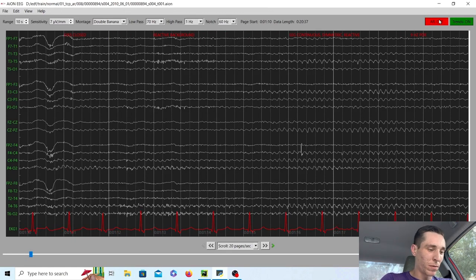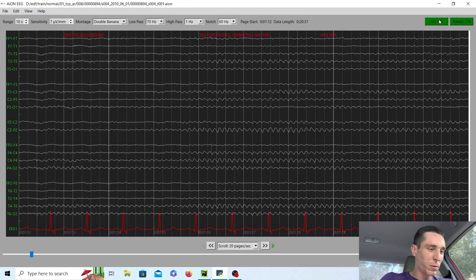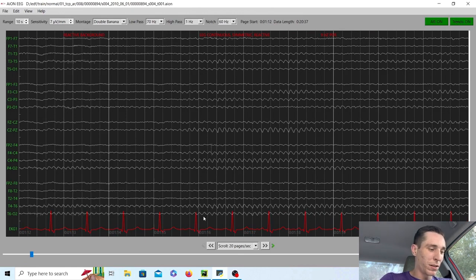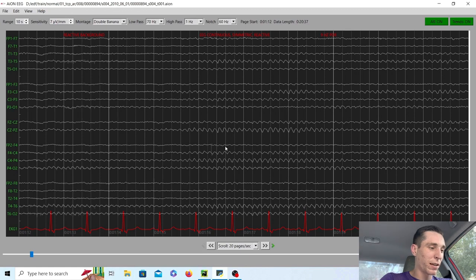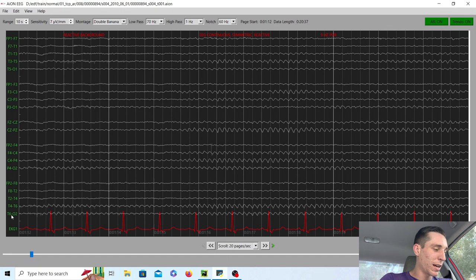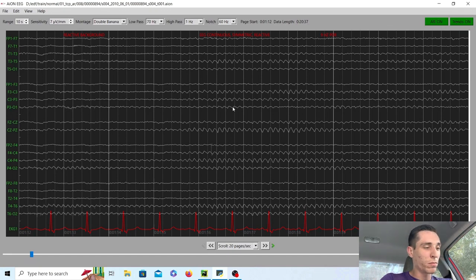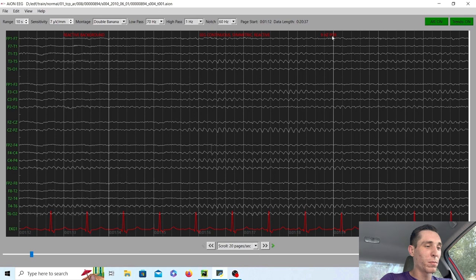Now, how many waves per second is the background? Well, if you count it, you'll end up seeing nine waves per second on both the left and the right side and the back of the head. O1 and O2, both of those, that's where you're going to want to count the posterior dominant rhythm or the PDR.